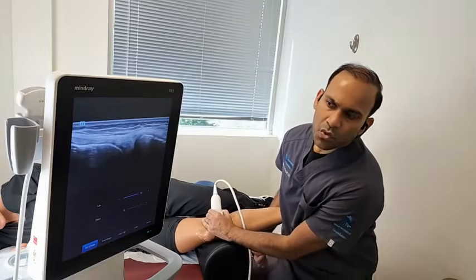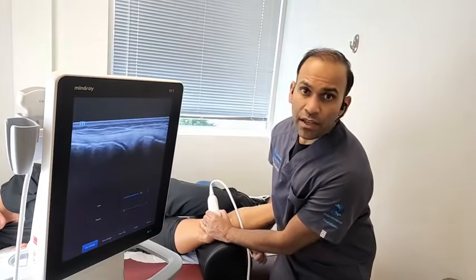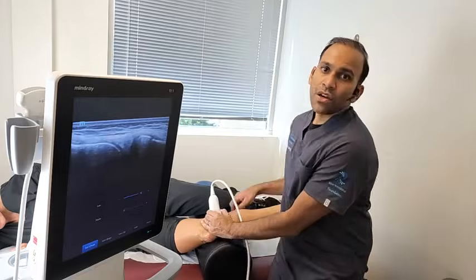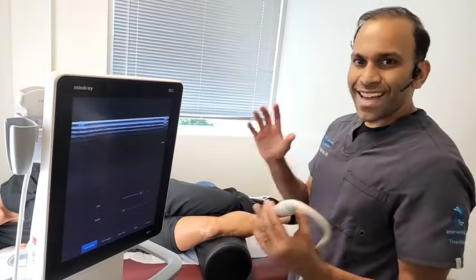But this is just one example of how we can use ultrasound dynamically to see what's going on in the knee, which is vastly different than looking at a knee with a static image like an MRI.